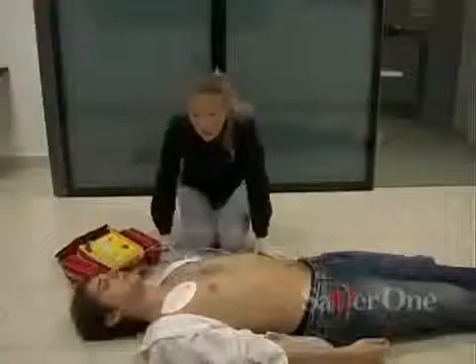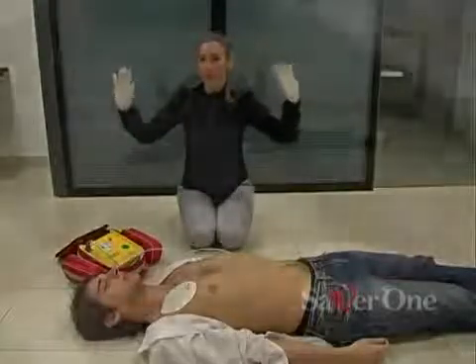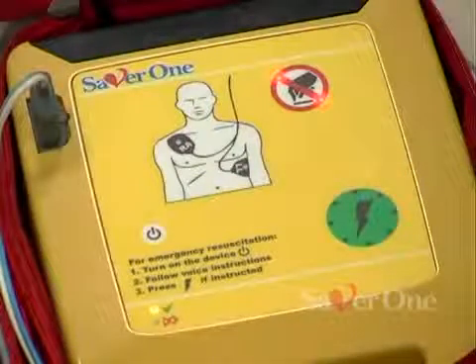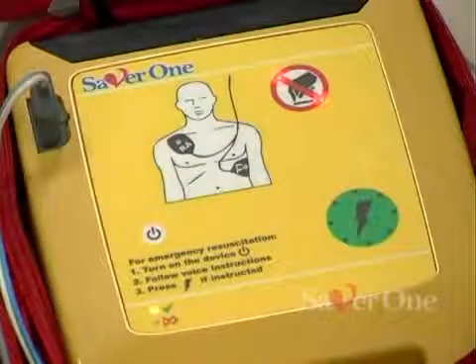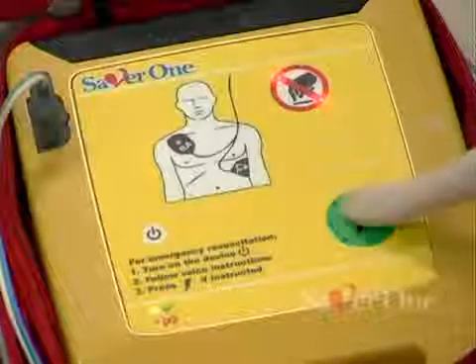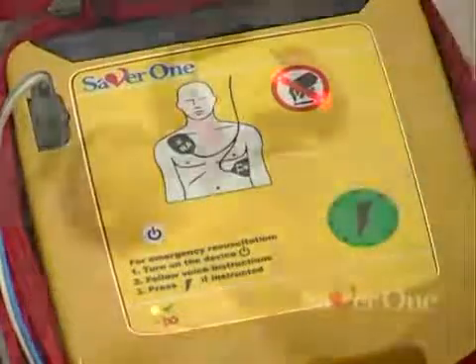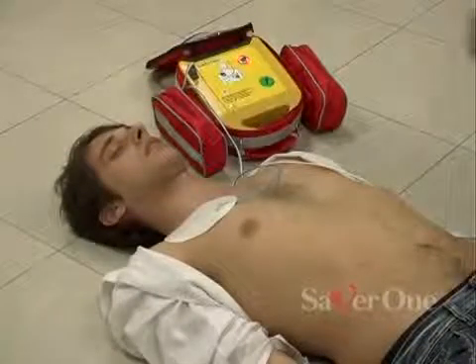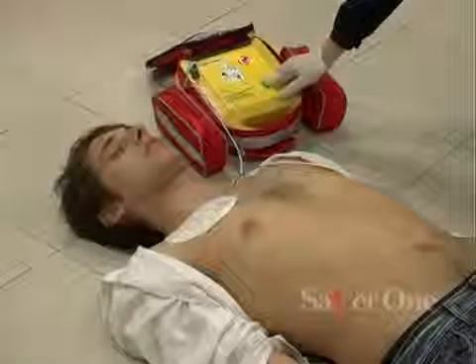Don't touch the patient — rhythm analysis. Shock advised. Charging. Press the green flashing button. The operator has 15 seconds to press the discharge button. Shock delivered — begin CPR now.